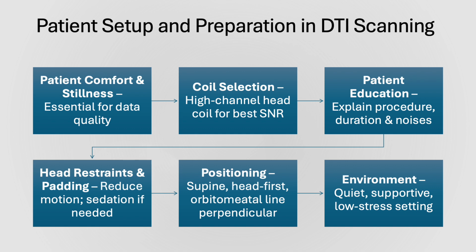So finally, the environment really matters. A quiet, calm space improves cooperation, and if possible, provide noise-canceling headphones and a squeeze alarm so that the patient feels safe and in control.